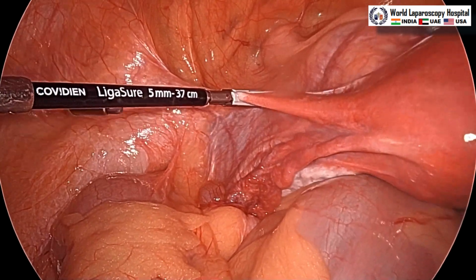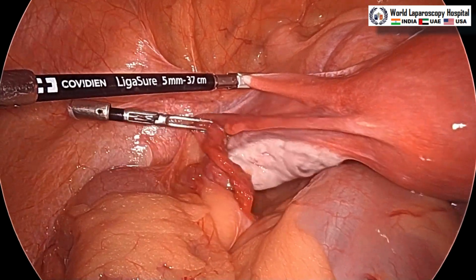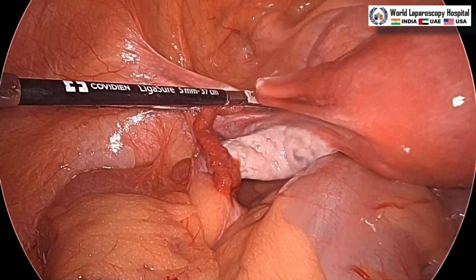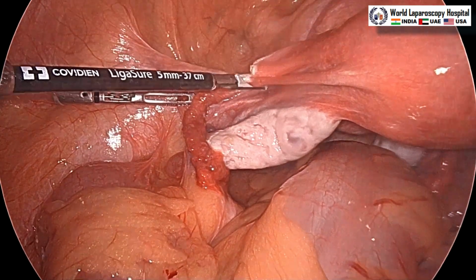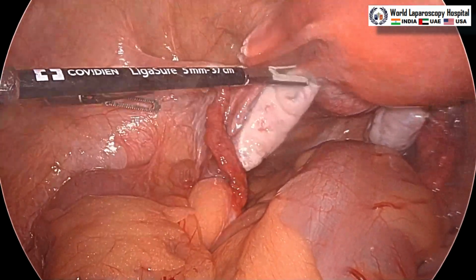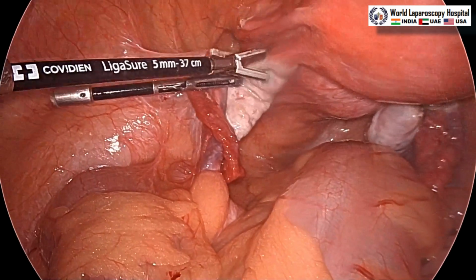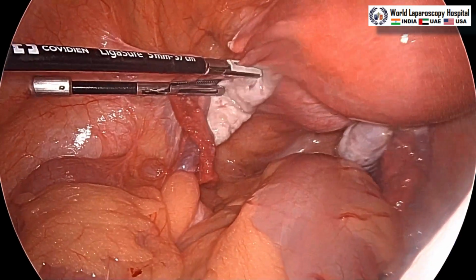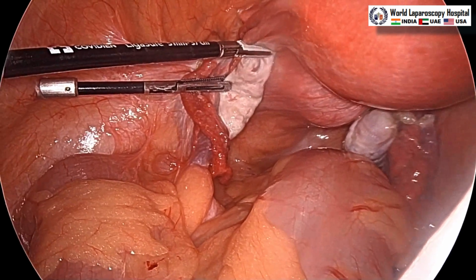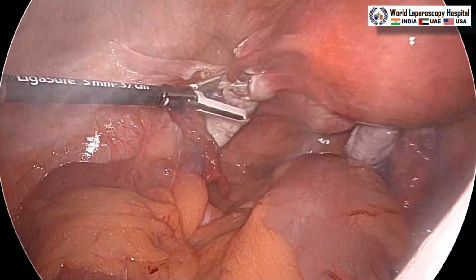So, this patient is an approximately 45-year-old multiparous woman with abnormal uterine bleeding and grade 1 uterine prolapse. So, we have given the option of TLH with sacrocolpopexy also, but we do not want to have the mess. So, we will do the suspension of the round ligament, and in this case we have to do appendectomy also at the end of the surgery.